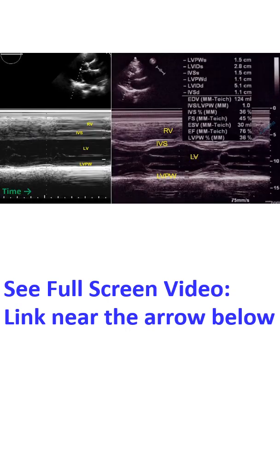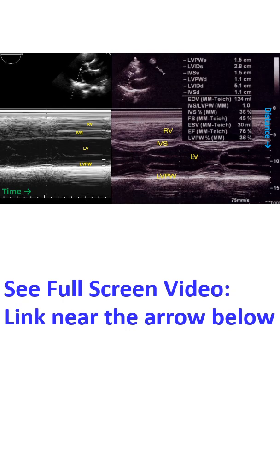M-Mode is a graphical representation of the movements of structures of the heart along a single scan line with time on the X axis and Y axis showing the distance of the structure from the transducer. Movements can be appreciated as a change in distance from the transducer with time.